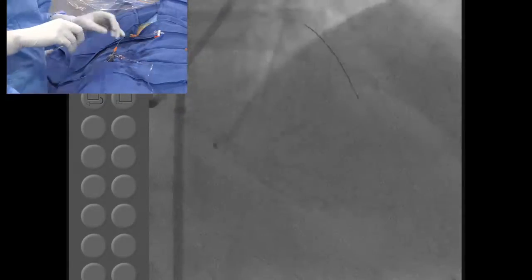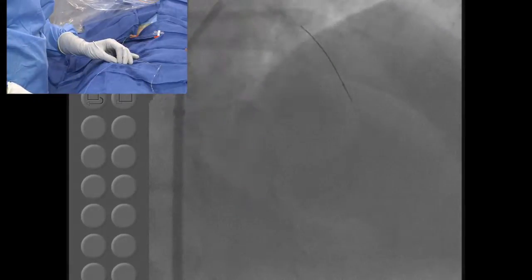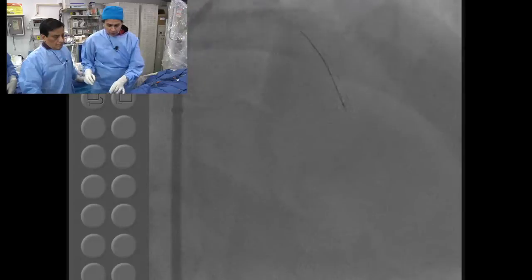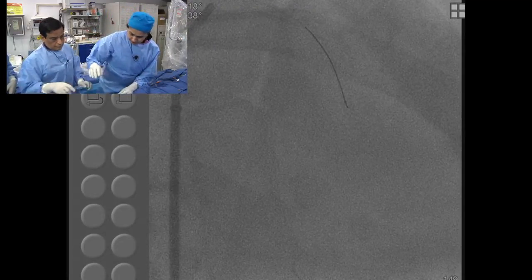Some dye there now. I know you didn't think there was any need to do a bilateral cannulation in this case? No, it's septal to septal collateral. We saw from the RCA, we didn't see much collateral. Six French base system? We have a seven French just because if you have to do the diagonal at the level stents, of the LAD, if you have to do... Two stents, yeah. Excellent. Take this out.